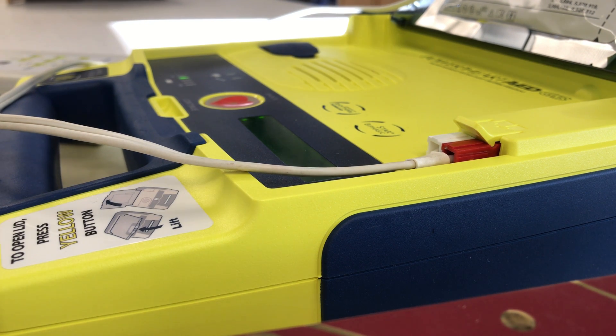It is now safe to touch the patient. Place the heel of one hand on the center of the chest between the nipples. Place the heel of the other hand directly on top of the first hand. Lean over the patient with elbows straight. Press the patient's chest down rapidly one-third the depth of the chest, then release. Start CPR.